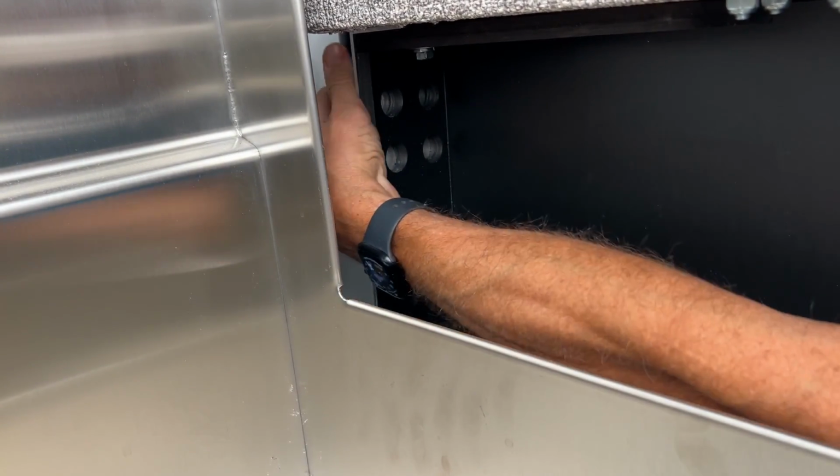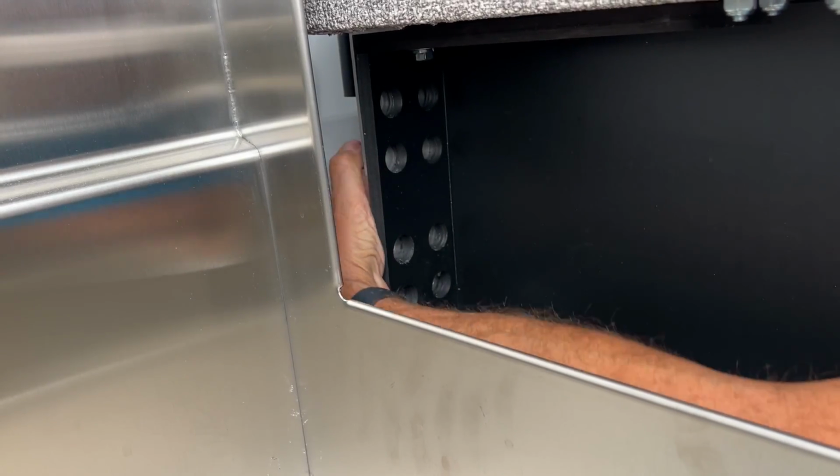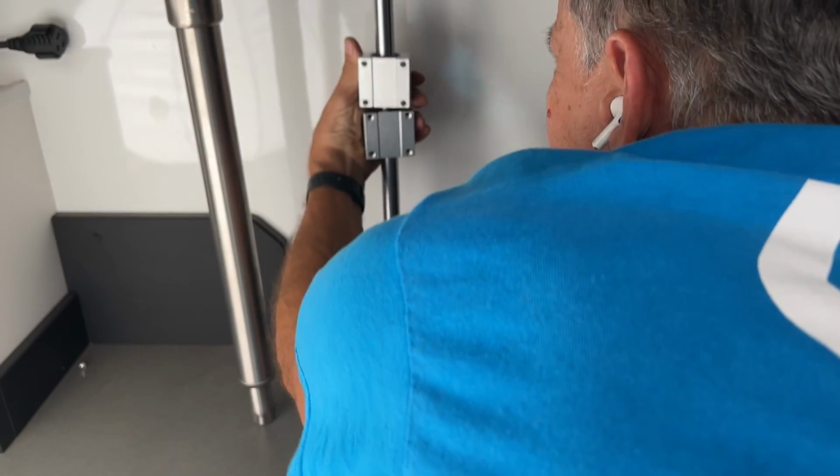Now let's loosen the bearings and then get under the table and slide the bearings all the way down off of the rail. Now grab your new bearings and make sure you don't grab your old ones. Grab the new bearings and put them on the rail. As you push the first one up, let it go up far enough so that the black box holds it in place. Then slide the second bearing up and trap both of them at the top behind the black box.